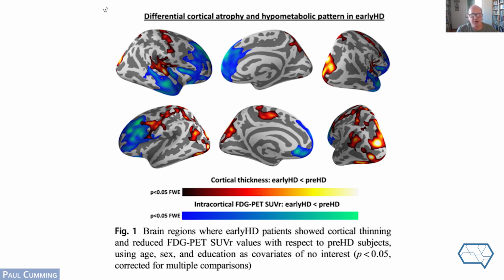And here they compared MR-based cortical thickness measurements, detected, I think these are called zebra images, where they have in effect projected a shaved brain that has been trimmed off so you can see the deep sulci and the underlying white matter revealed in the same surface rendering of the brain. It's a common problem in all brain imaging, how to represent the complex 3D surface using only the 2 dimensions of the printed page or the computer screen.